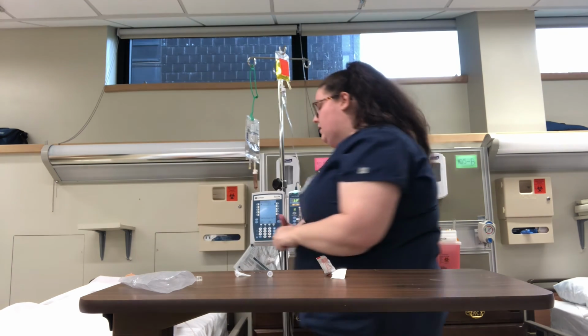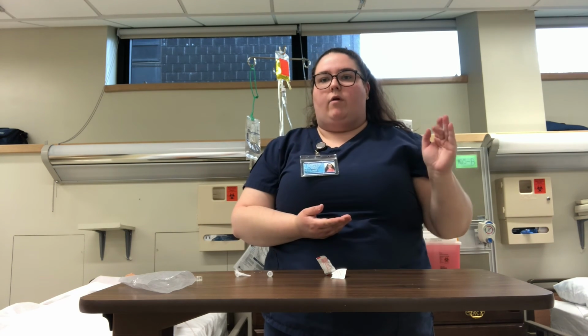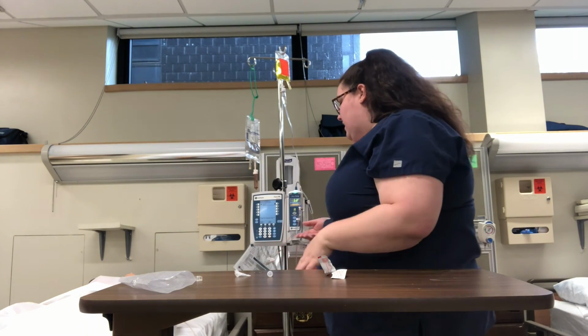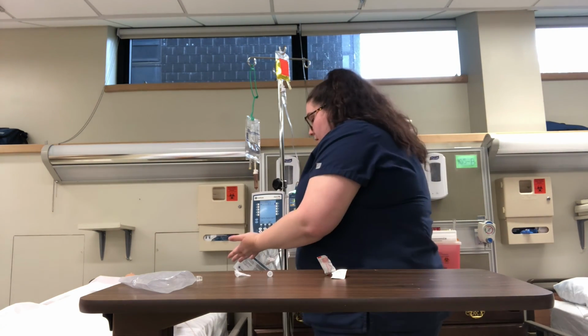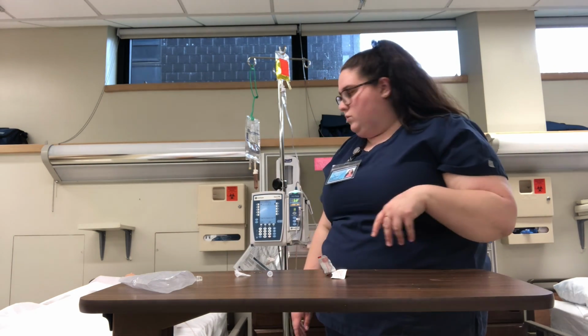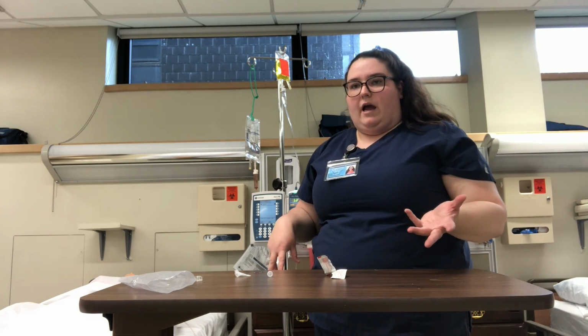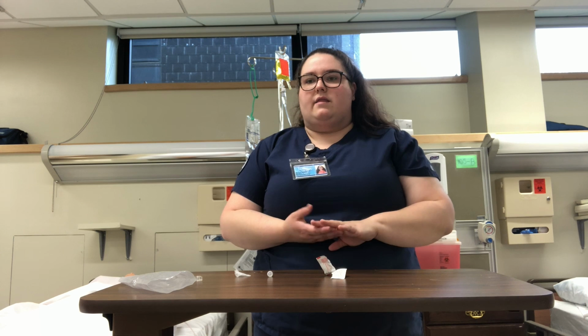And before I ran this, I would have assessed the IV site for any swelling, redness, or infiltration. And now while it's running, I'm going to ask the patient if they feel any burning or any discomfort. I see it's running properly. I'm going to give the patient their call light, tell them we'll be back in half an hour, and I'm going to go document the administration of the medication, the tolerance of the patient, and the IV site.